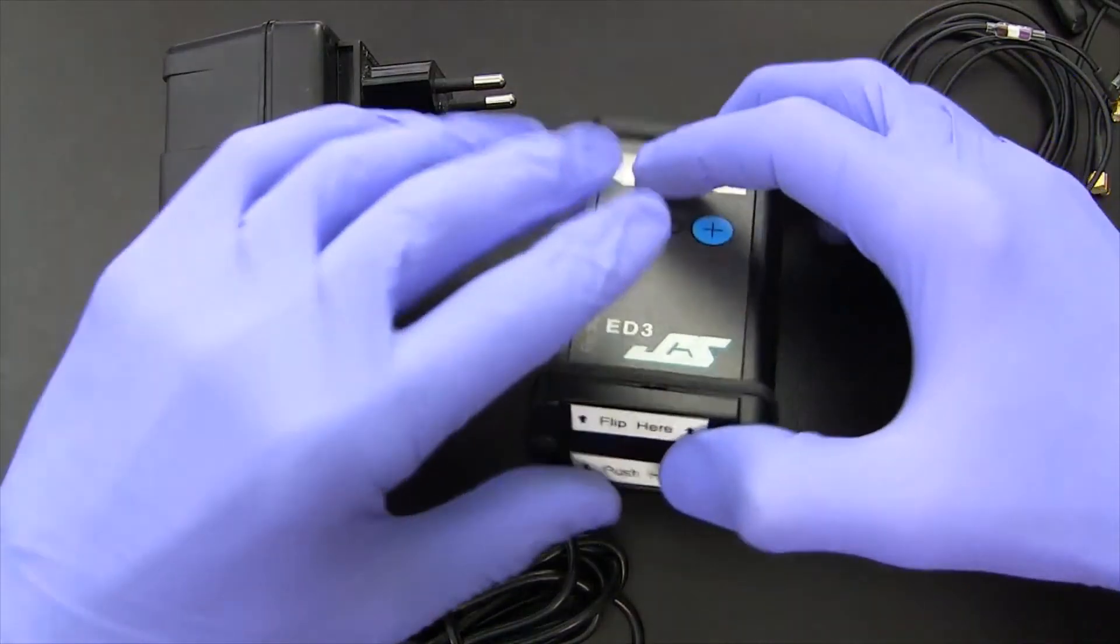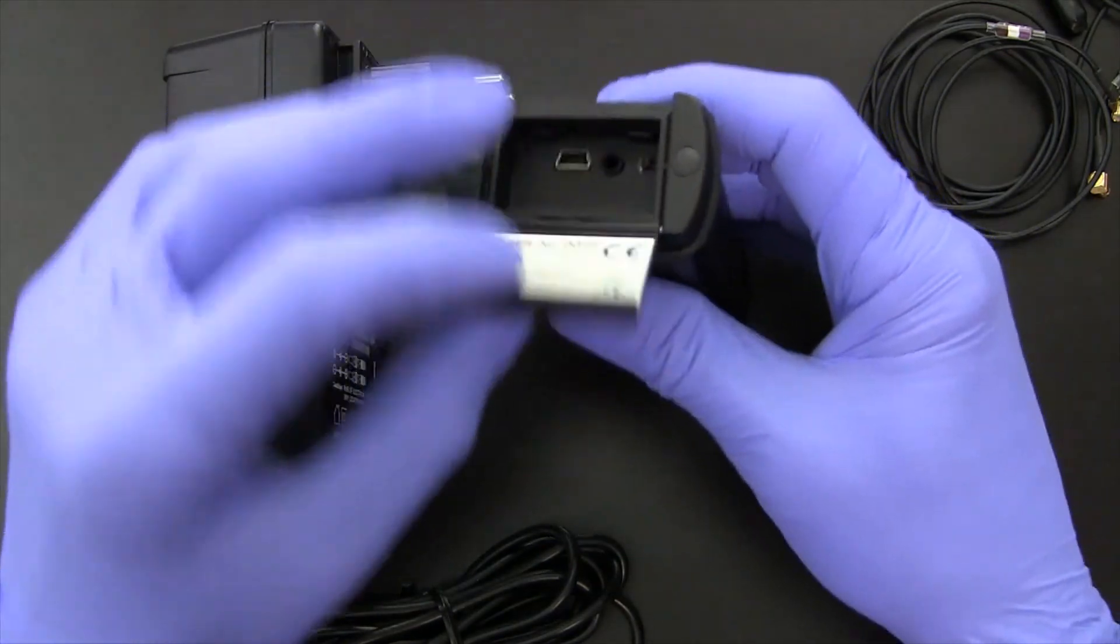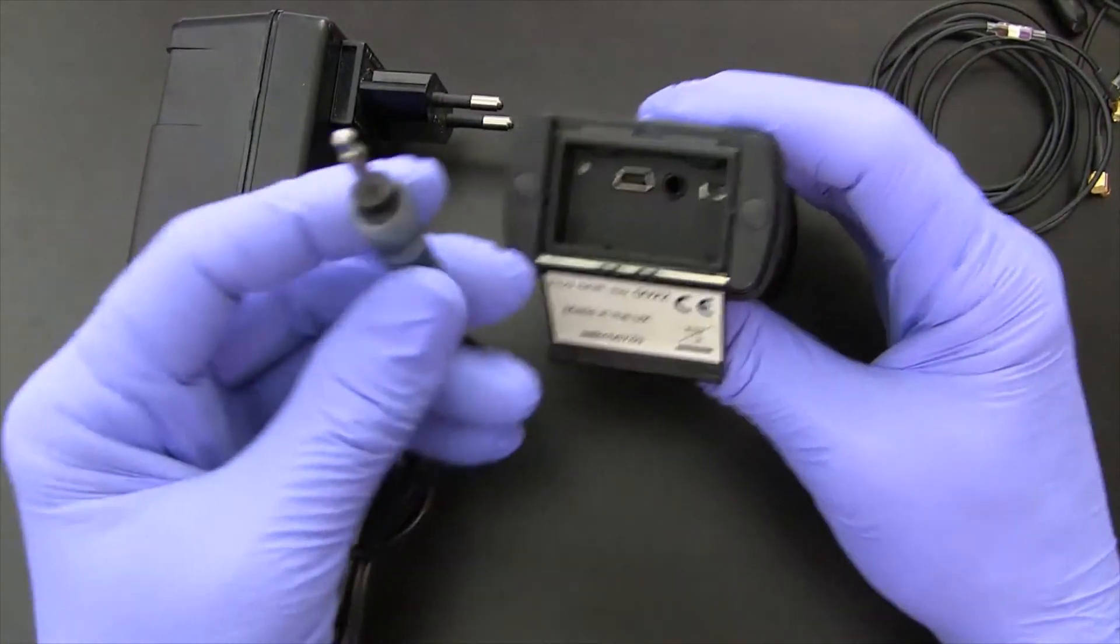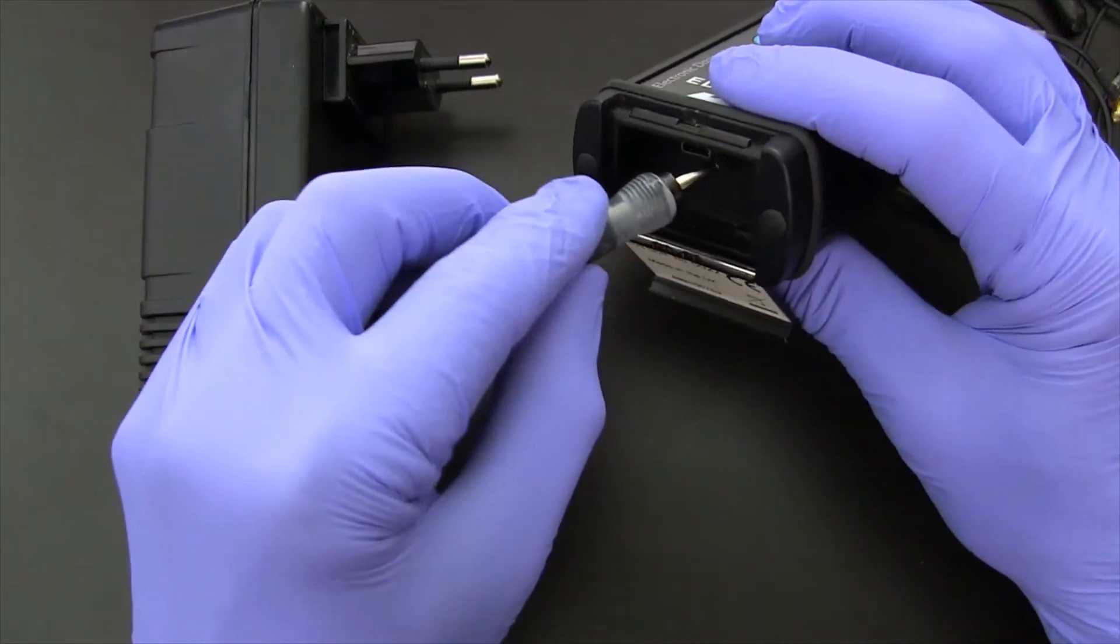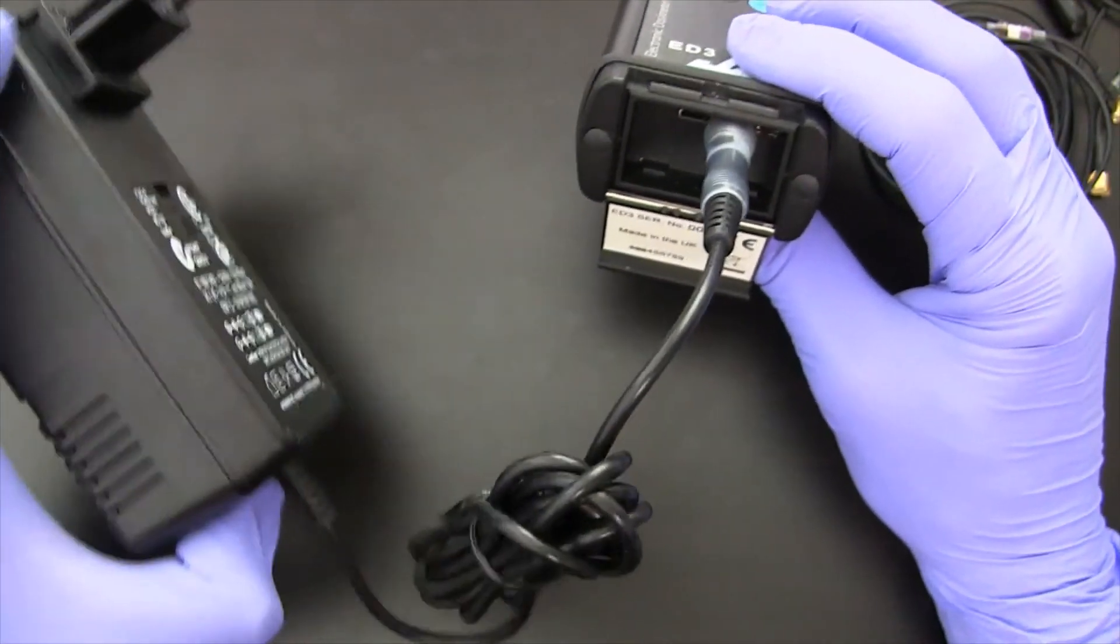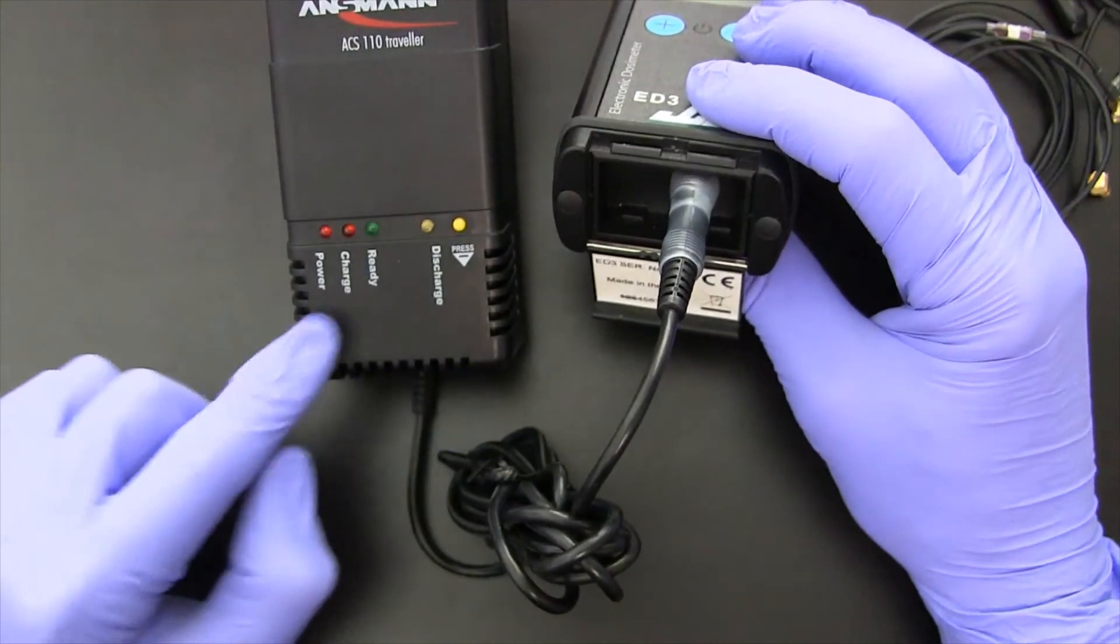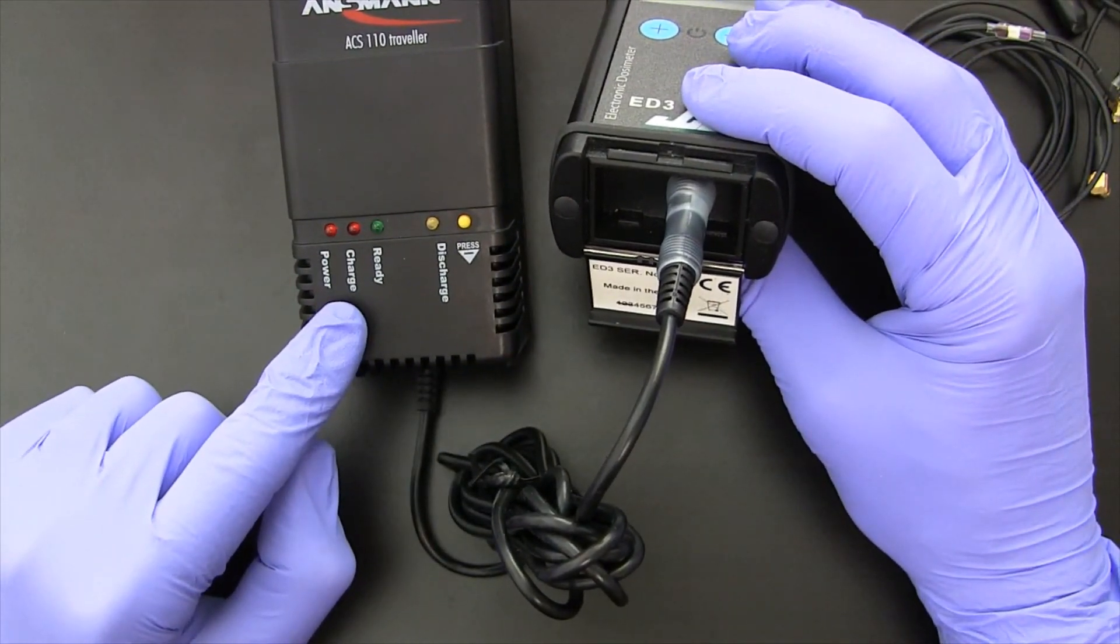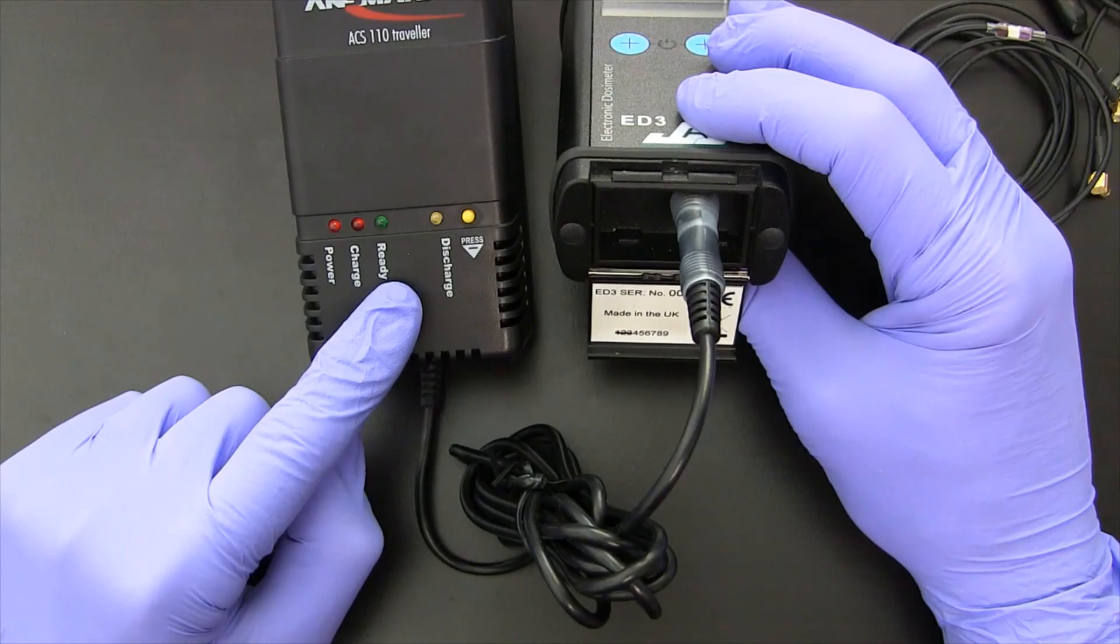When it's time to charge the unit, all you do is open up the back, select the charging adapter, plug it into the charging port, and then plugging it into the wall. The lights will indicate what's happening, so effectively when the unit is fully charged, the green light will come on and say ready.